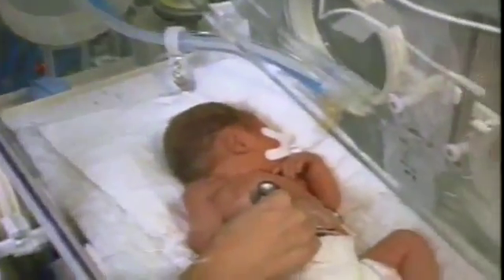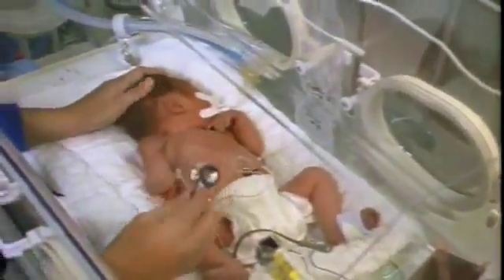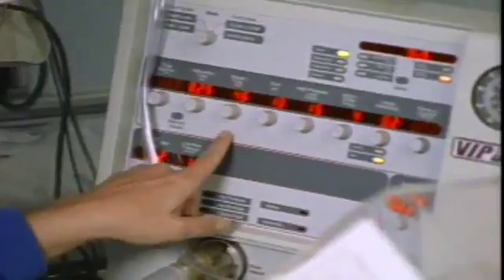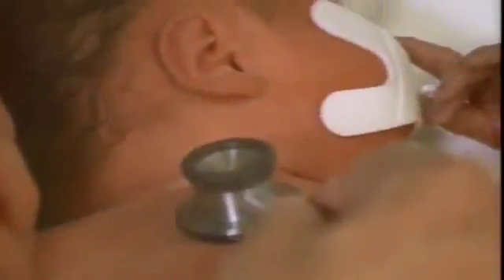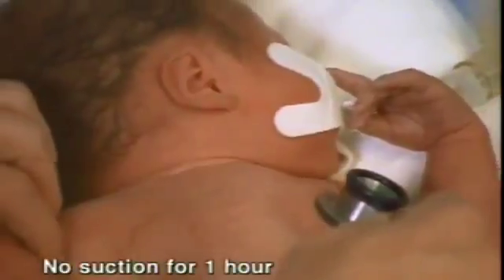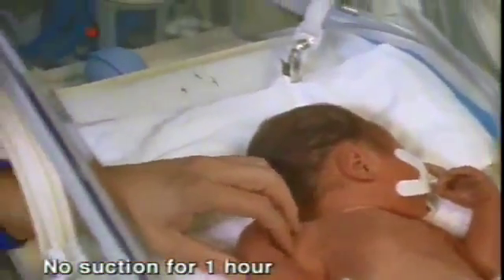Closely monitor oxygen status, airway pressure, and respiratory rate. When compliance or oxygenation improves, or if cyanosis or bradycardia occurs, adjust the ventilator appropriately. In controlled clinical trials with Surfactant, the most commonly reported adverse events were transient bradycardia and oxygen desaturation. Don't suction the endotracheal tube within 1 hour following a treatment unless occlusion is suspected. Continue to ventilate as needed.